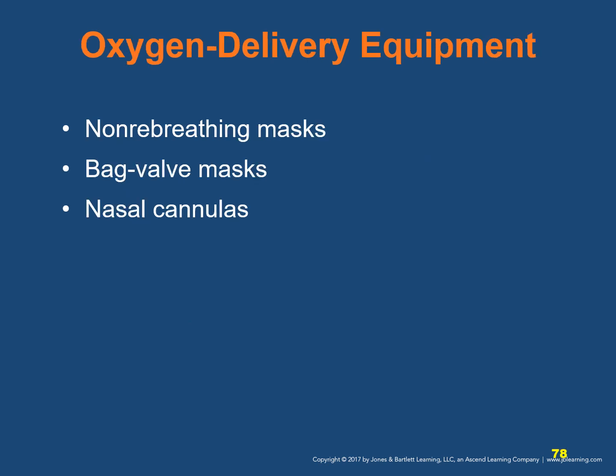Now we're going to talk about oxygen delivery equipment. In general, oxygen delivery equipment used in the field should be limited to non-rebreathing masks, BVMs, and nasal cannulas. You may encounter other devices during transports between medical facilities.